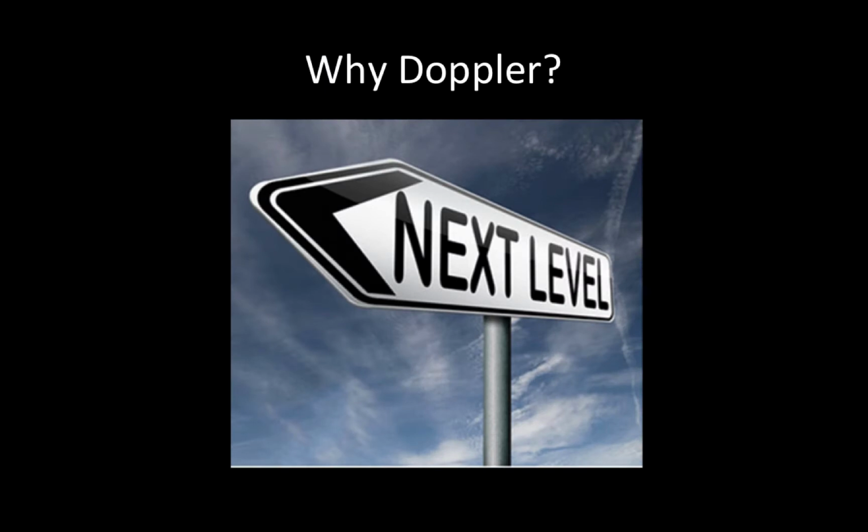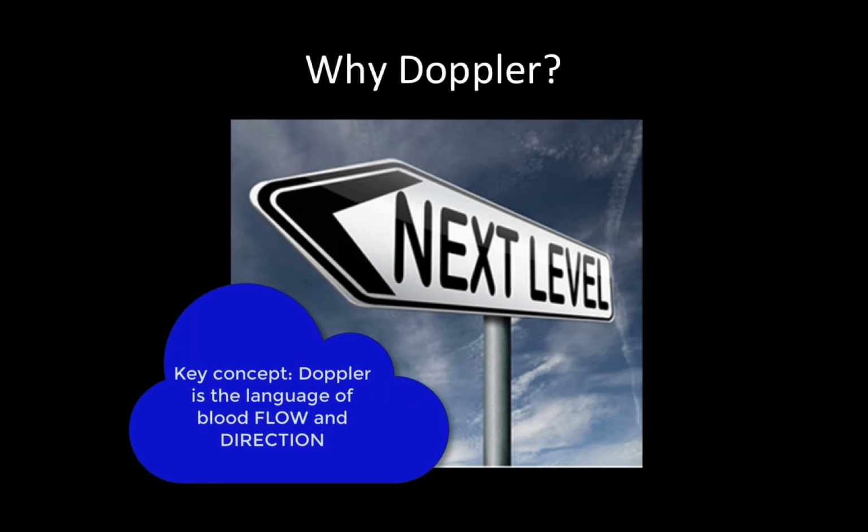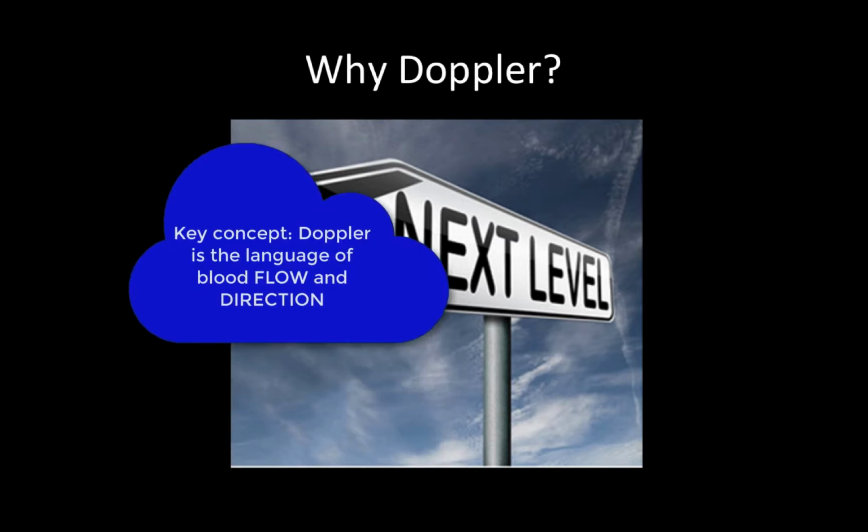Now you may be wondering why it's worth it to understand the principles of Doppler physics. So Doppler is the language of blood flow and direction, and a basic understanding of Doppler principles really allows you to progress to the next level of POCUS. Once you understand the core principles, you can translate them to a whole host of other applications.